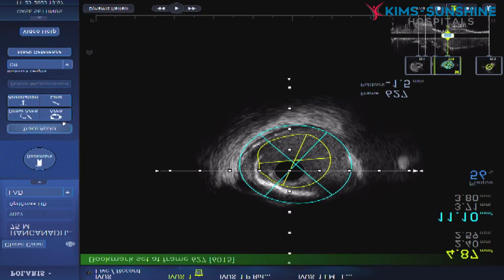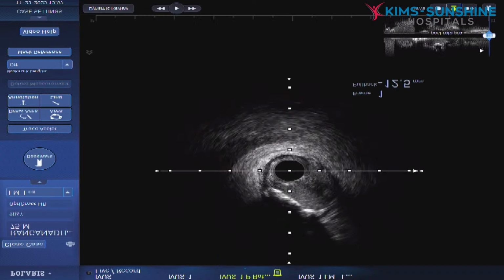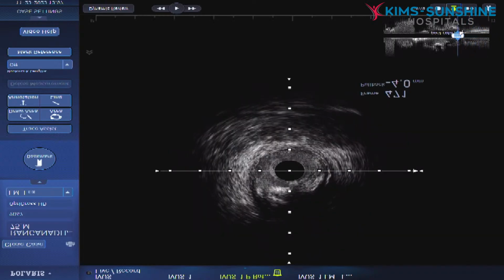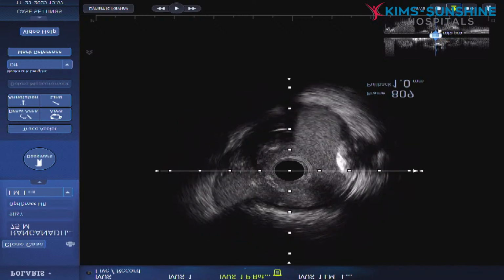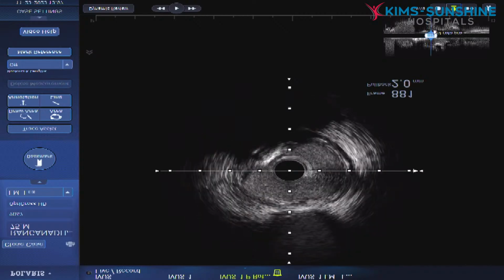See, whatever we are seeing in the distal left main, I feel that will be much bigger. We have to do cutting, scoring, give a scoring balloon. 2.5, that is the LCX size I want. Previous. Move back side. Move. Still. No, here you take area. Go back. Take here. I think it will be around 3. We'll take 3. Measure.